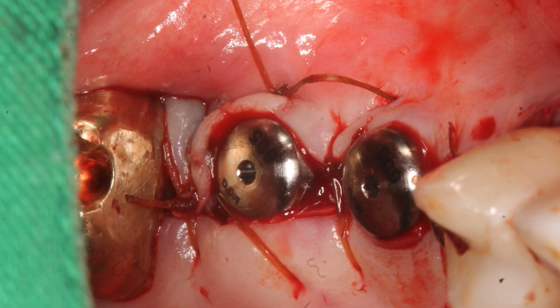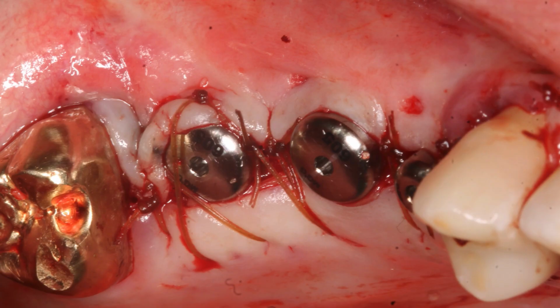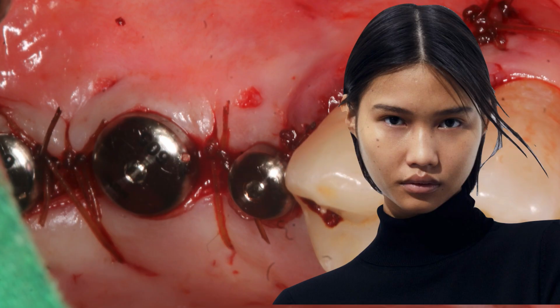So here we are, we made a good attempt, and the tissue seems to be sitting on the facial surface, and a couple more sutures were put into effort to pull that down, and eventually when we corrected everything, we got this turtleneck effect.